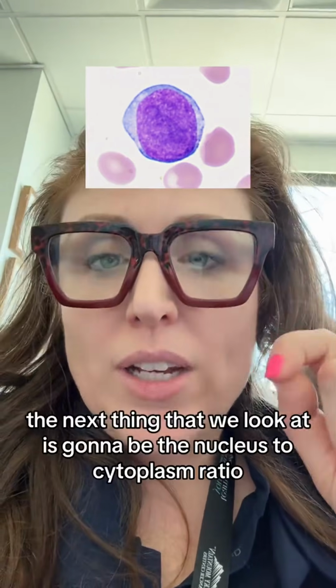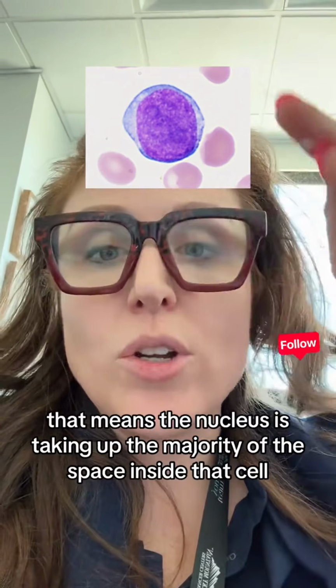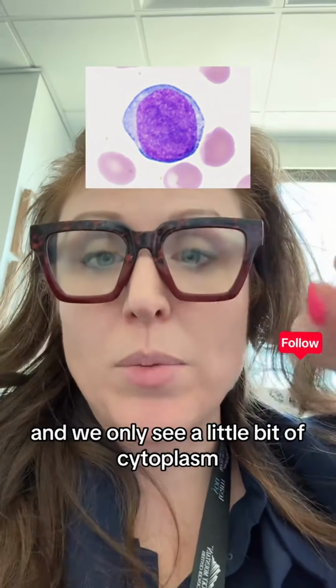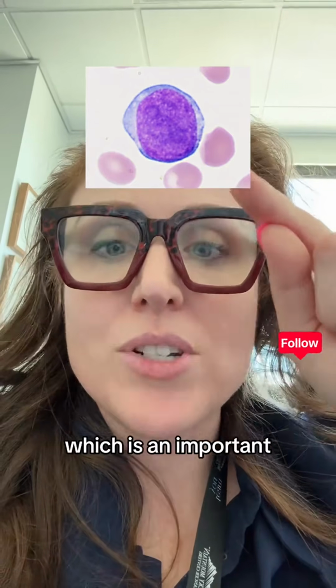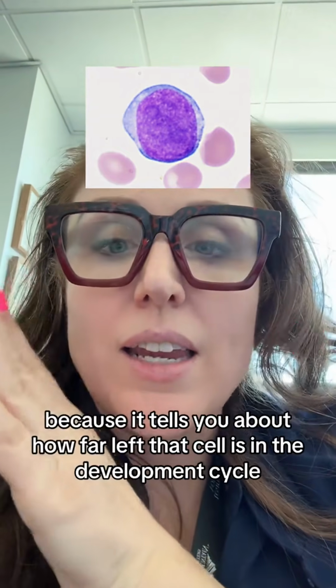The next thing that we look at is going to be the nucleus to cytoplasm ratio. In this cell, it is extremely high. That means the nucleus is taking up a majority of the space inside that cell, and we only see a little bit of cytoplasm. Next thing to look at is the nucleus. And in this case, we can see clear nucleoli, which is an important thing to look for because it tells you about how far left that cell is in the development cycle.